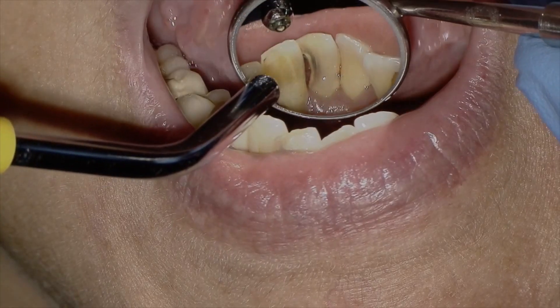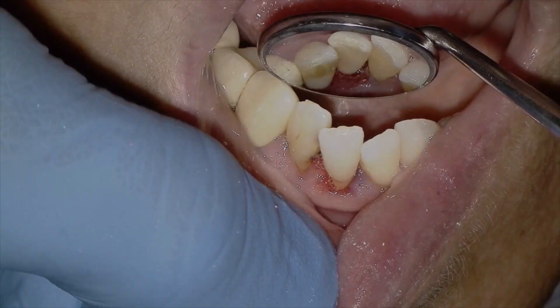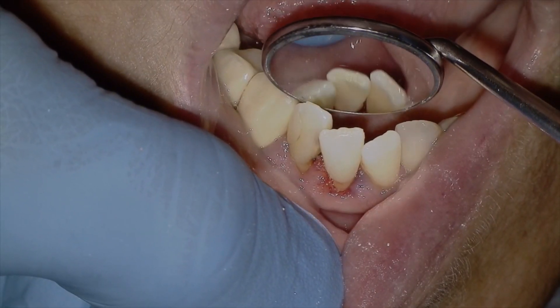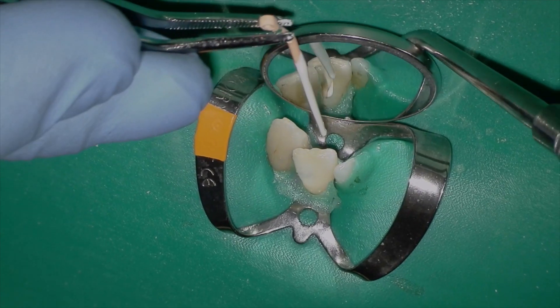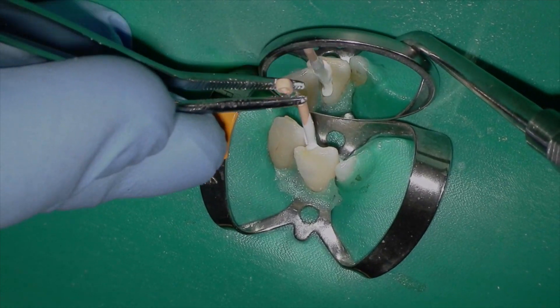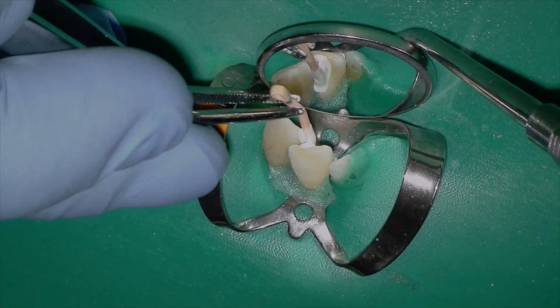The beauty of dentistry is that you have the opportunity to take someone out of pain and restore their teeth to function and aesthetics. In this case, you're going to learn about how to predictably endo-treat a mandibular incisor and restore it in under an hour.